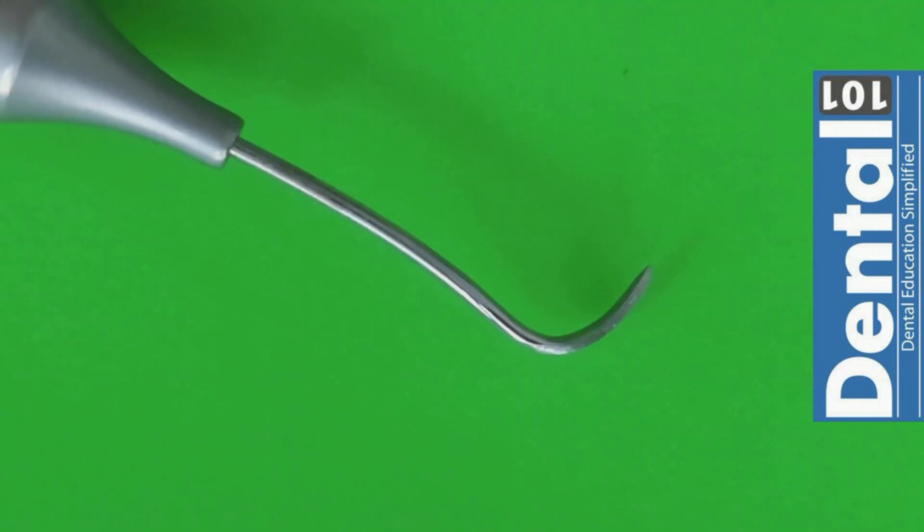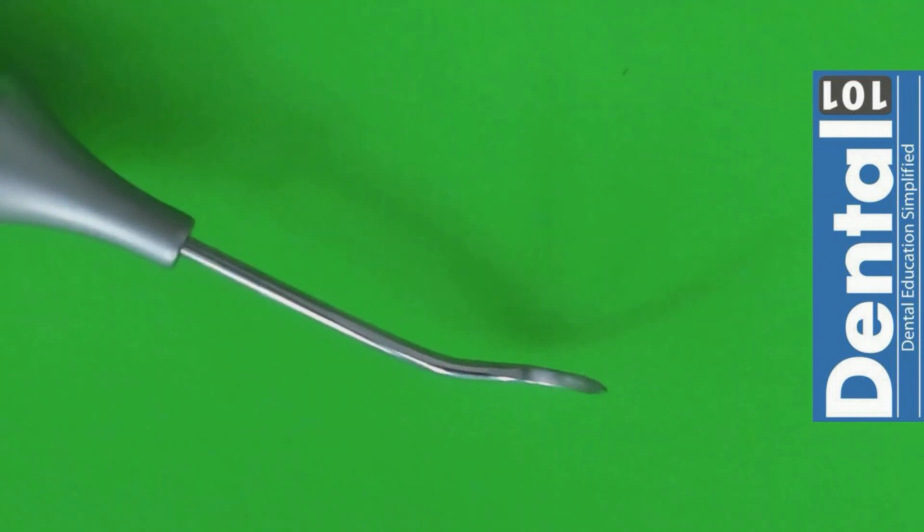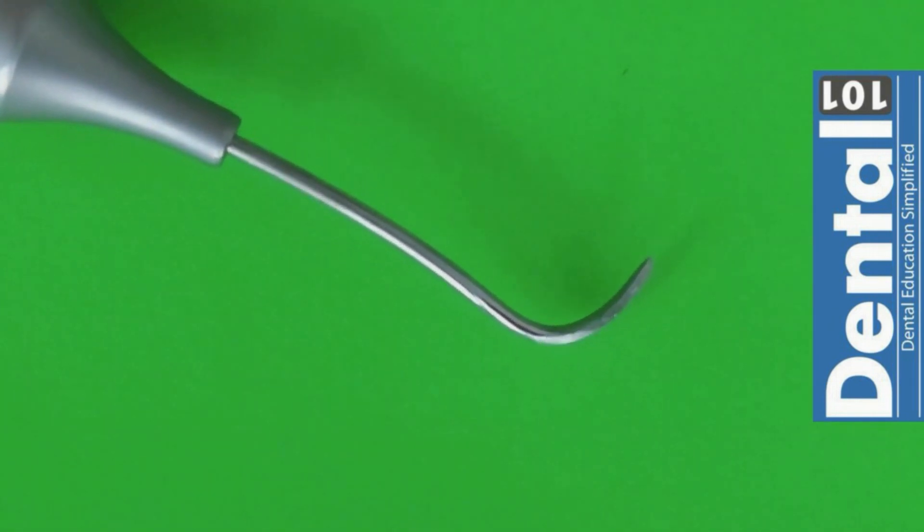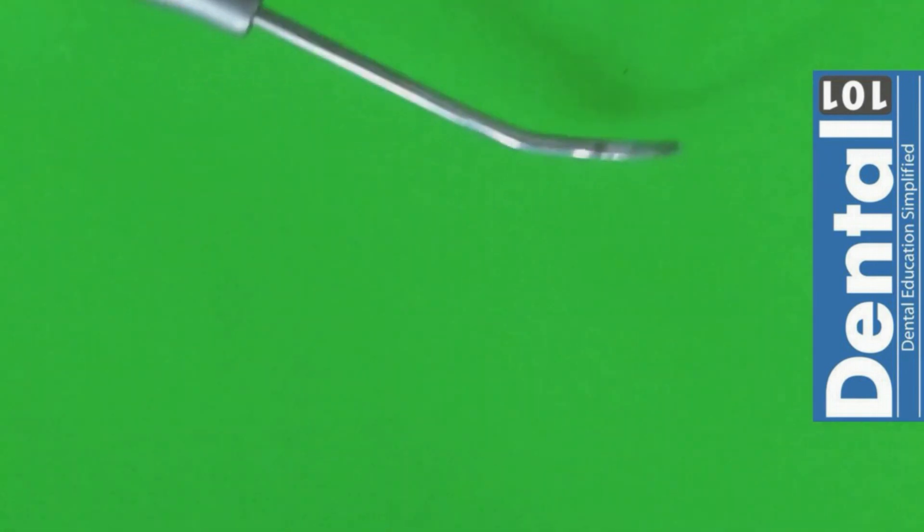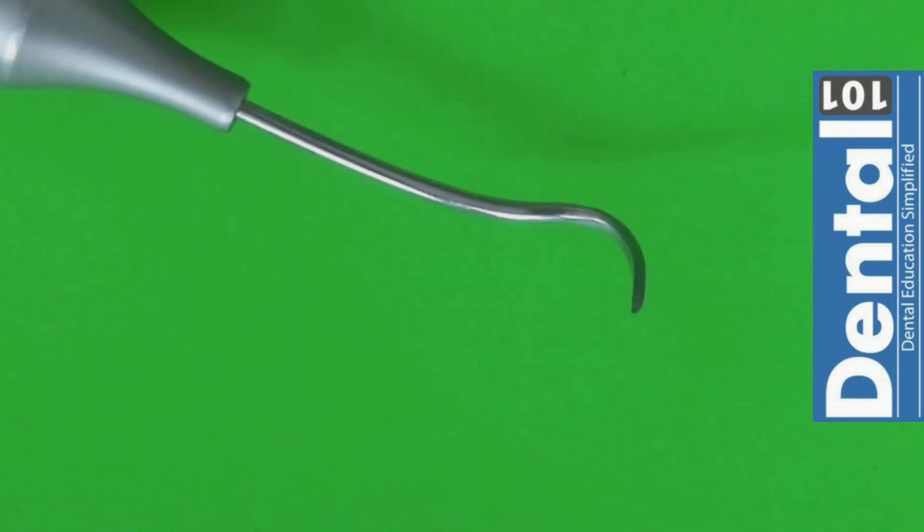Now we have the Wiland carver which is basically used for adapting interproximal surfaces for amalgam or composites so you can identify if you are having any kind of overhangs or excess. The Wiland carver is going to help you reach those places that are difficult to reach with other instruments.